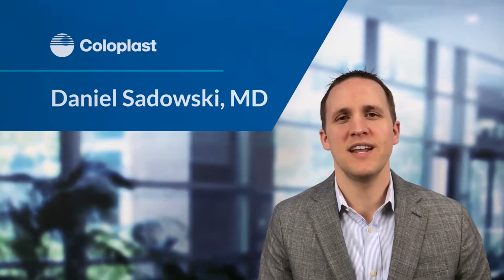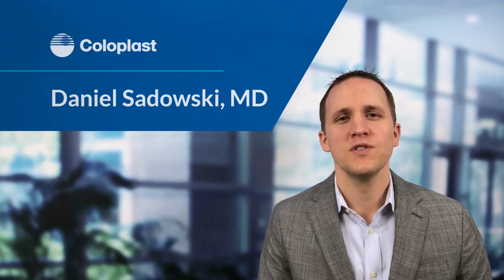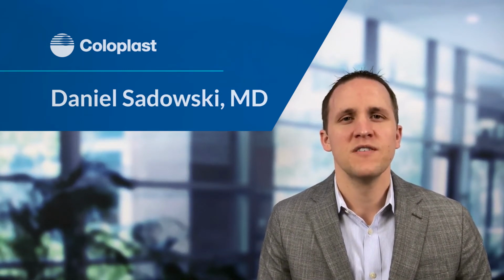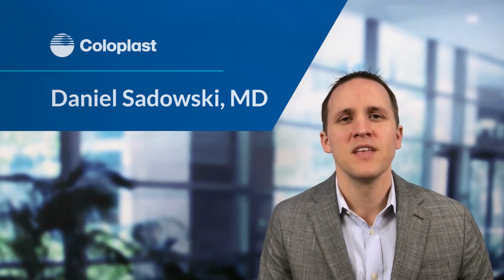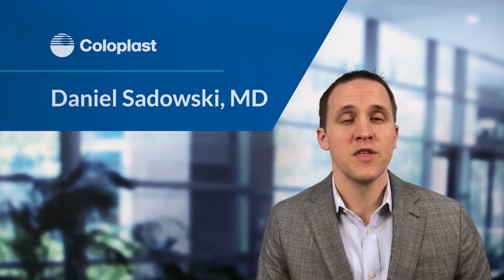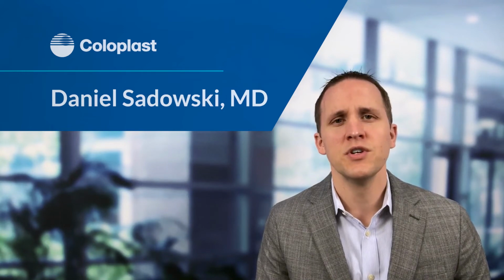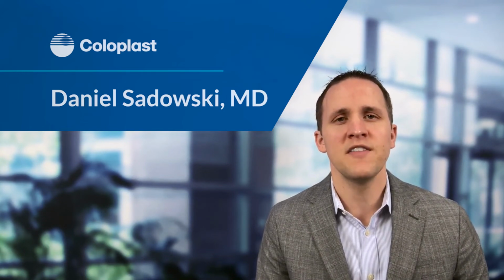The inflatable penile prosthesis holds normal saline, which is just salt water, which is physiologic in the human body. That is what is contained within the reservoir, and when you pump up the device, it goes into the cylinders to fill the penis and to provide the erection.